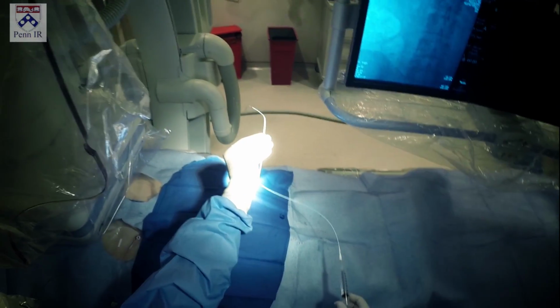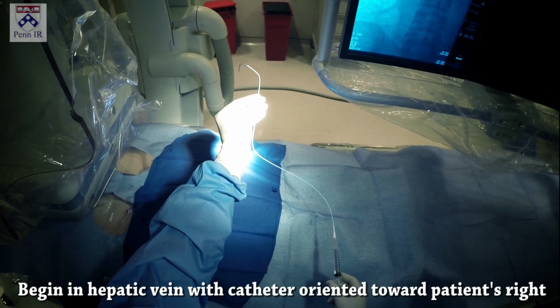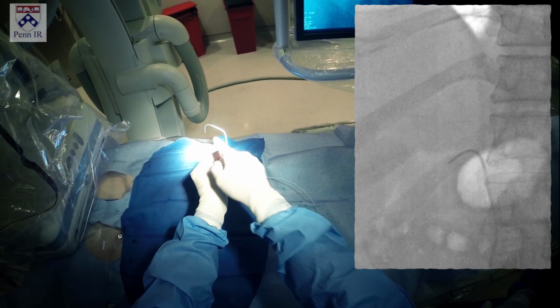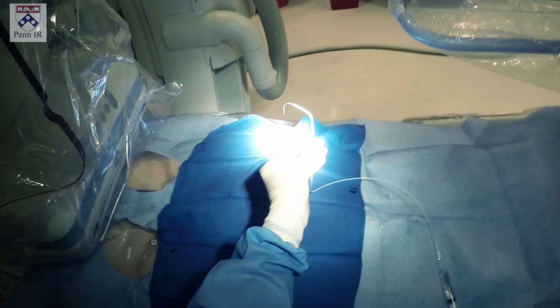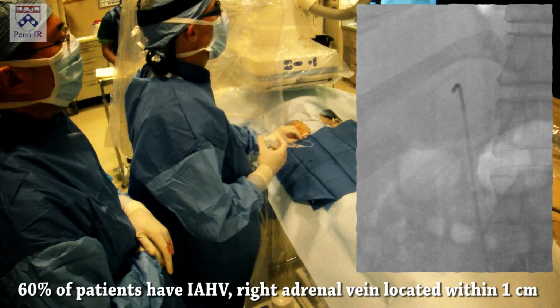Another thing we can do is look for the inferior accessory hepatic vein. If we start in the hepatic veins with the catheter turned completely to the right, as we pull down, we'll first see it pull out of the hepatic veins, and then as we pull it down, if we see it pull into another hepatic vein, we found the inferior accessory hepatic vein. If the patient has one, and about 60% of patients have one, the adrenal vein is going to be within a centimeter of that vein.